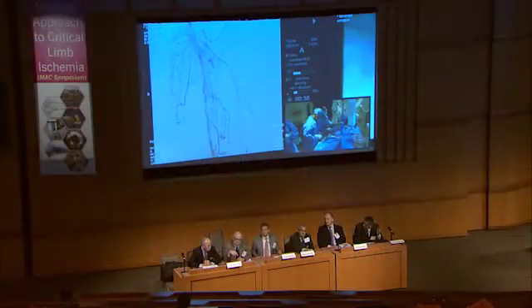significant. I really appreciate the comment of compromised runoff and how that may change your threshold to consider. And this is a non-tabled decision, it's all relative. Do you think it's bad enough? I'd say I'd probably just use a nitinol stent at this time, looking at that contribution. Thomas, this was your suggestion to begin with, so how do you rate it now?